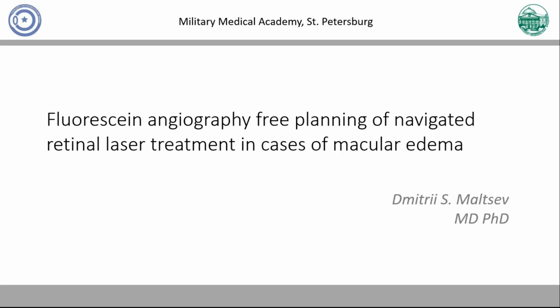Dr. Maltsev has had the Navilas laser system since 2014, and since then he has intensively studied how to use multimodal diagnostics to perform an optimal laser treatment. Today, he will share his experience on the use of en-face OCT for replacing FA in DME and CSCR treatments.